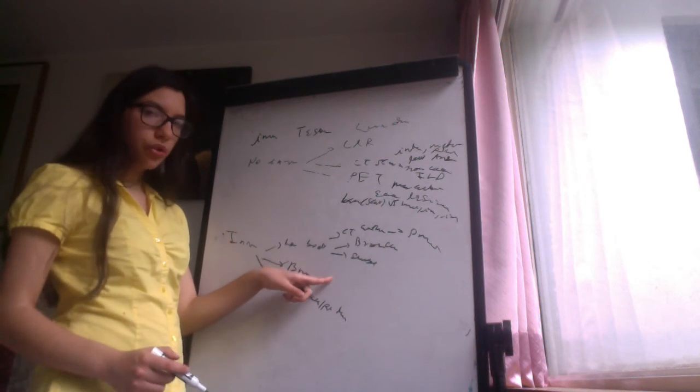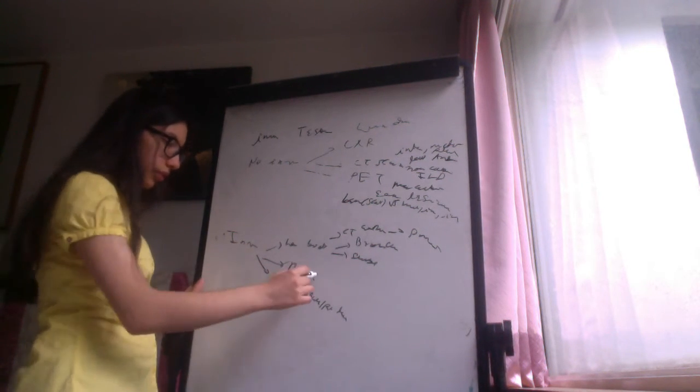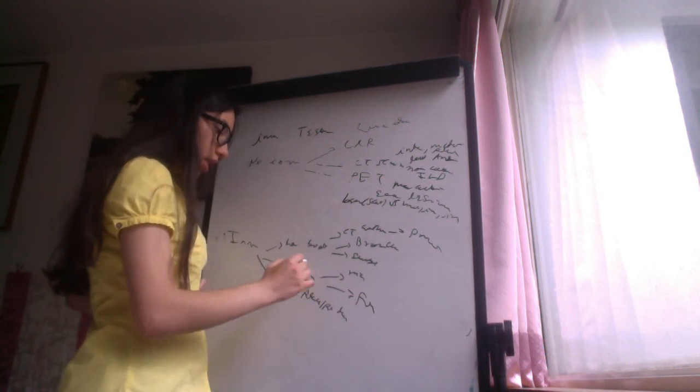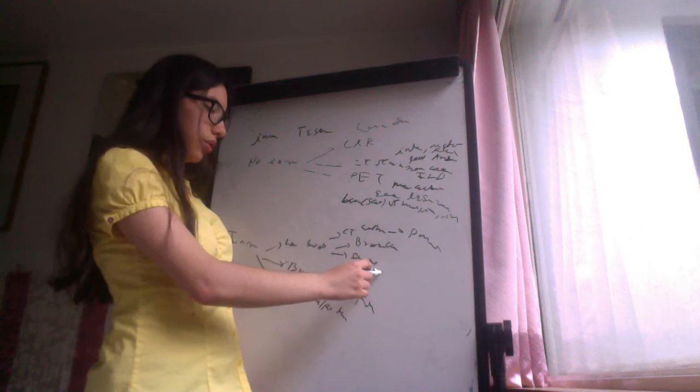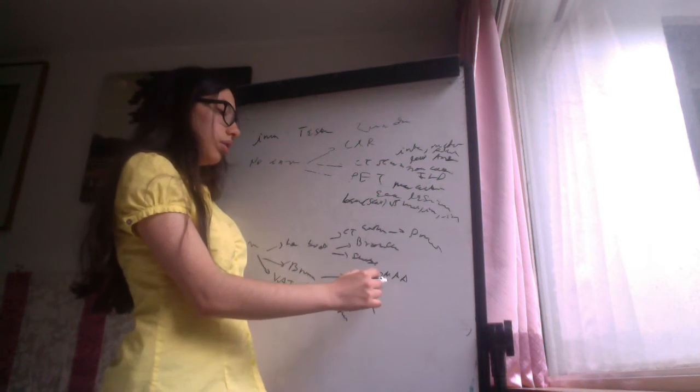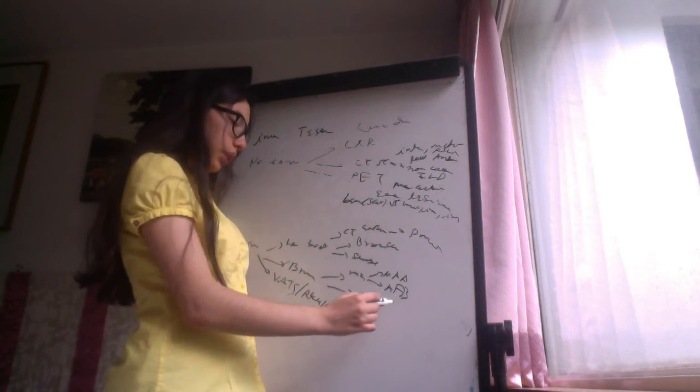Now, the bronchoscopy can be rigid or flexible. Rigid bronchoscopy is used in management of advanced airways, or aspiration of foreign body.